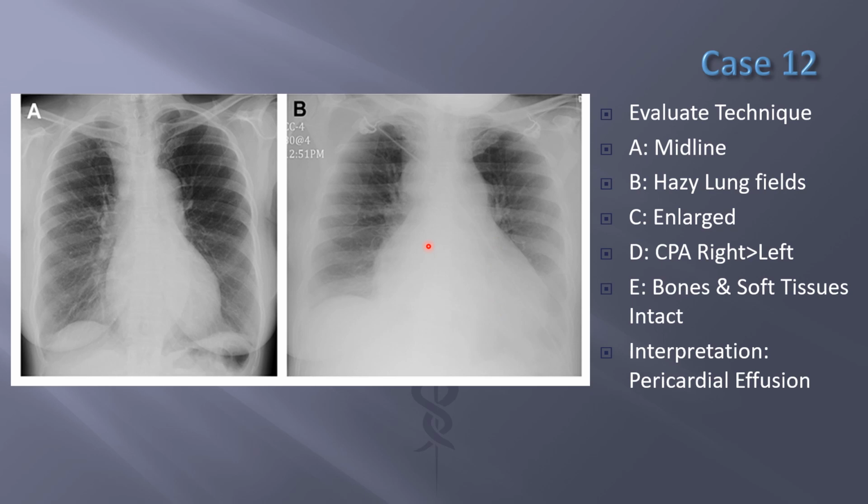And this could also be a medical emergency because this fluid builds up and can cause cardiac tamponade, where it's squeezing the heart and it can't generate enough cardiac output or blood pressure. So this is an emergency. You need to call a cardiothoracic surgeon, or if you work in an ER, that ER physician or a PA, if trained, can place a catheter under the xiphoid into the pericardial space to drain the fluid.